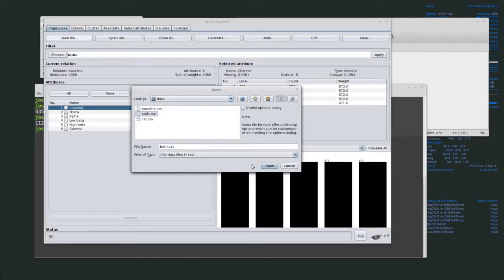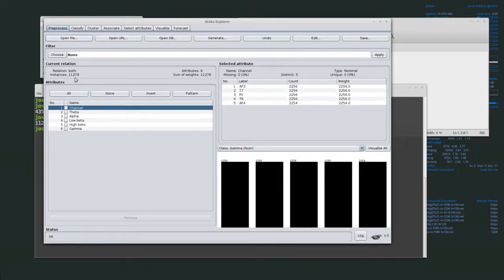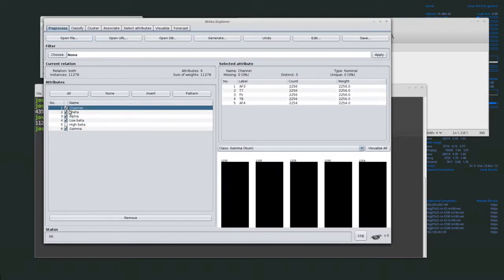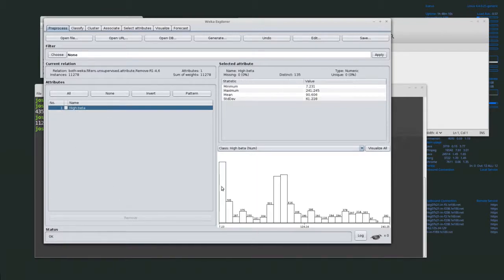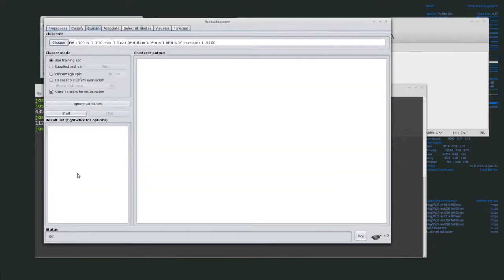Now I go back to Weka and open both.csv. We have as many records as expected with all the same attributes. Since I'm really only interested in high beta, I select everything I don't want to include and click Remove. Now I have high beta only — all the combined data — and I can already see there's quite a few entries with some interesting variation.